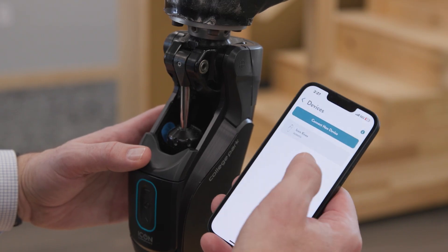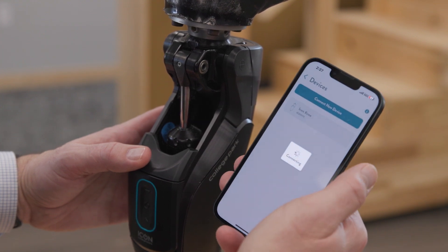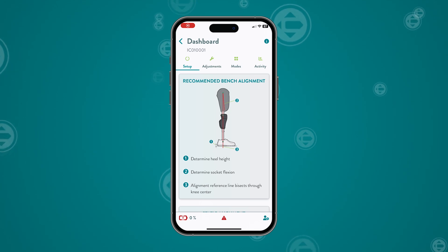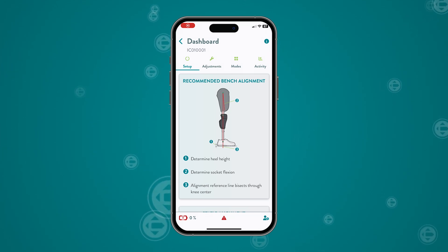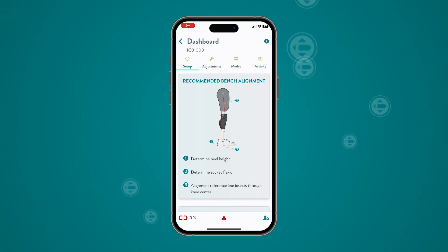The Icon knee uses Bluetooth to pair quickly with the Stride Studio app. You are now ready to fit the knee. The dashboard screen is the main hub of the Icon knee programming software. It provides access to all setup functions and critical information about the knee.